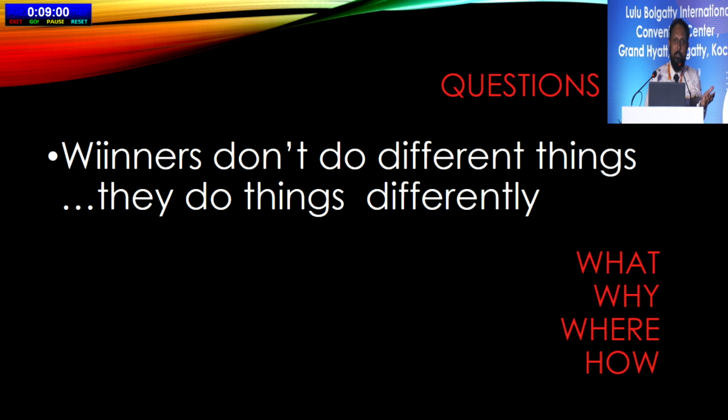We all know it's made of 4 parts. It's got the basic optical system, the illumination system, the arms or the hands, and the stand and the foot pedal. And then basically it is divided into 3 groups. You have the basic microscopes, then the mid-range microscopes, and the high-end microscopes, which have other attachments like the Callisto and the OCT guided microscopes. So if you have any questions from the audience regarding microscopes, the companies, the cost, or where to use which microscopes.